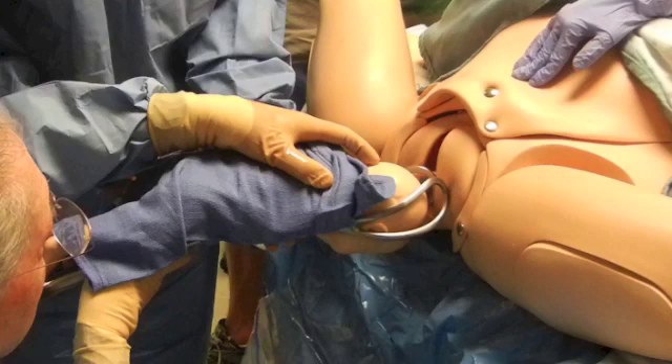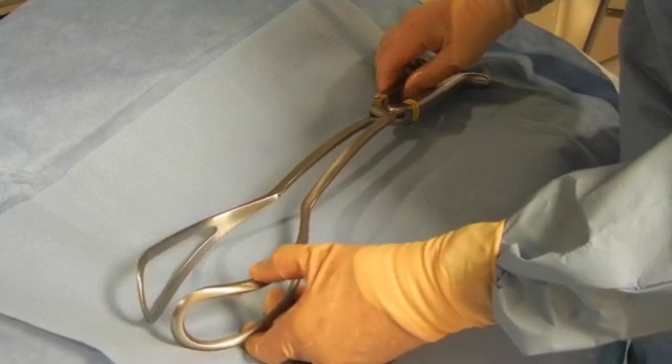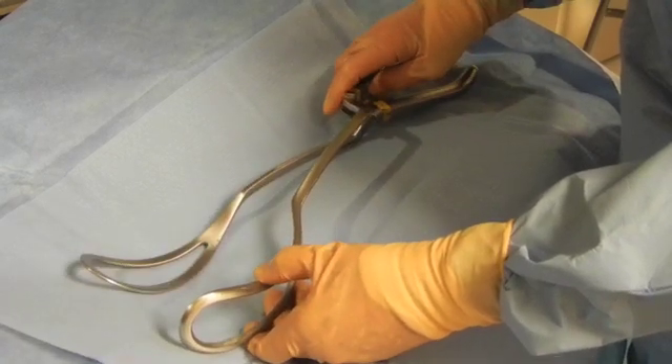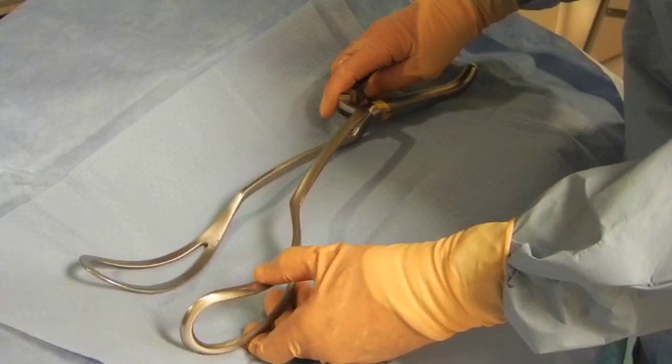These blades are applied as a straight pelvic application. It doesn't matter if the baby's head is turned to the left or the right. You are not trying to get the bi-malar application you would normally do for a vertex delivery. Also different from forceps in the instance of a vertex is that these blades are applied from below upward.